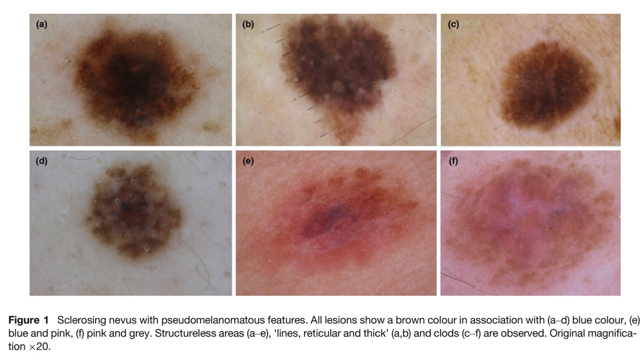Here we have another example, and we can see that all lesions show brown color in association with blue, blue and pink, and pink and gray color. Structureless areas, network and lines, and clods are present in these cases with a different distribution.